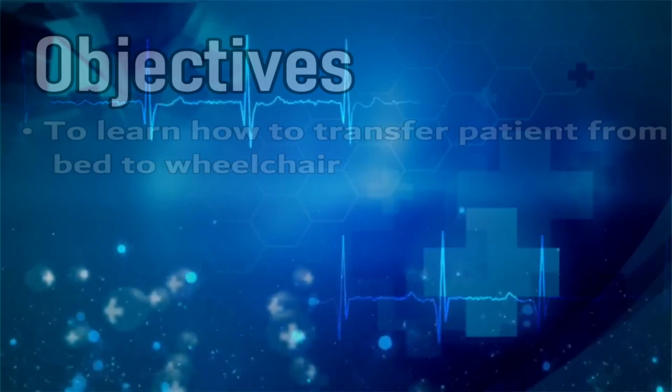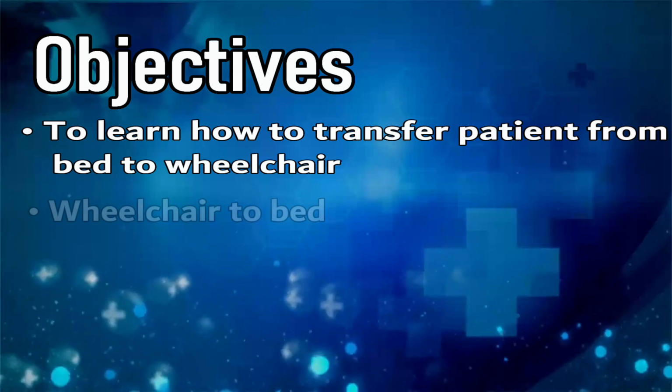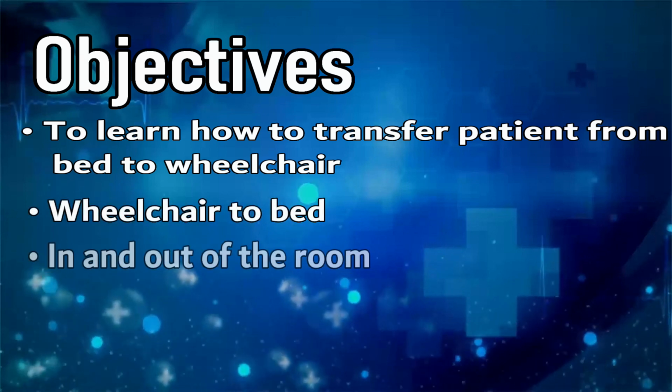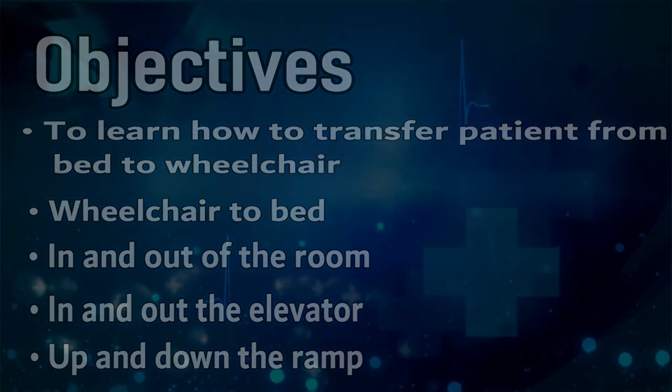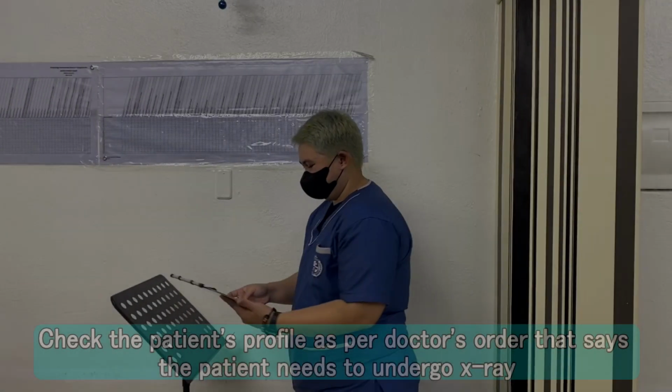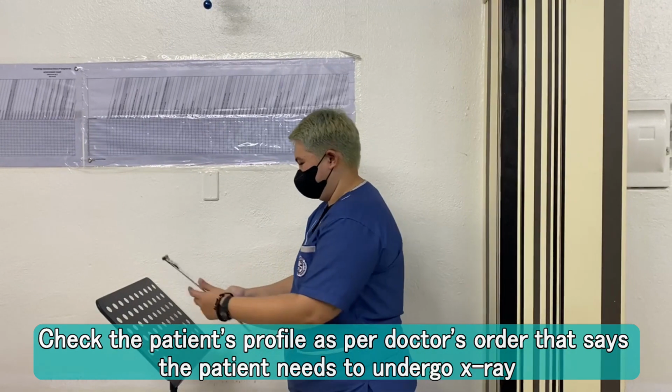Objectives: to learn how to transfer a patient from bed to wheelchair, wheelchair to bed, in and out of the room, in and out of the elevator, and up and down the ramp. Check the patient's profile as per doctor's order that says the patient needs to undergo X-ray.